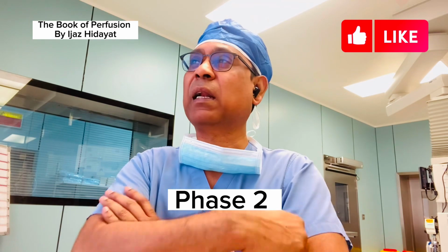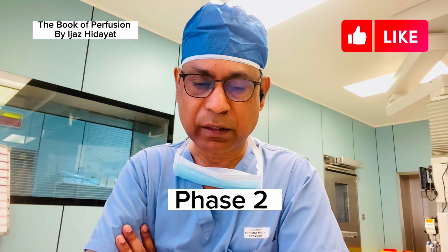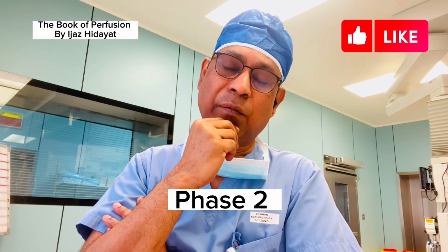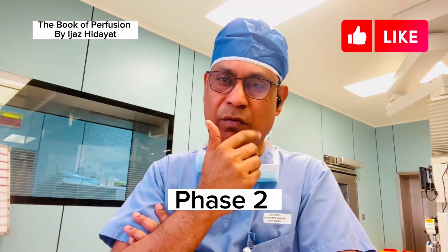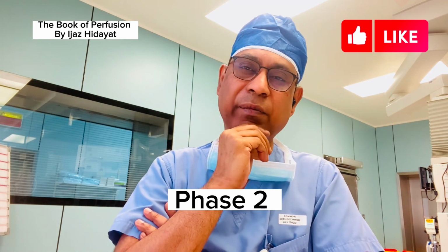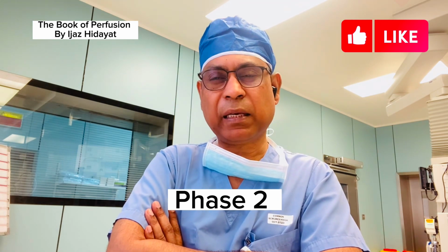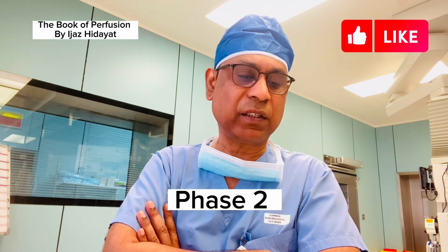The patient gets fully heparinized, and we monitor that ACT should be more than 400 seconds prior to cannulation of the patient. For the routine cannulation of the recipient, we cannulate the ascending aorta, as I discussed, with an 18, 20 or 22 French EOPA cannula, and the right atrium with a 34, 36 or 32 French two-stage venous cannula, and then we cannulate the PA for venting to prevent PA distension or right heart distension.